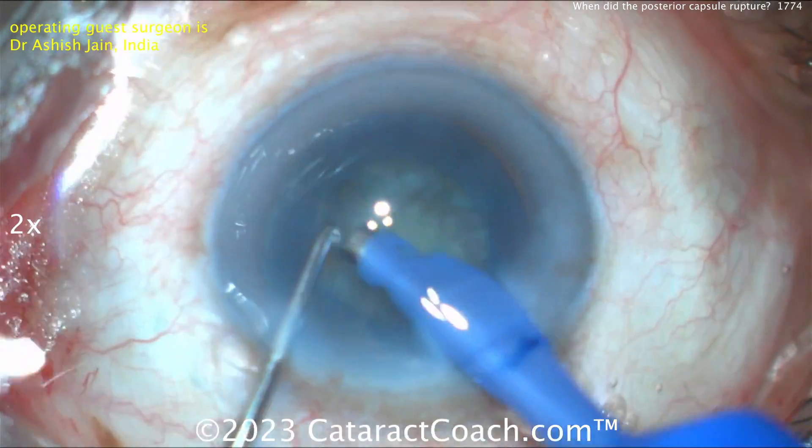Put more viscoelastic, but you may want to check for vitreous — maybe put some triamcinolone inside the anterior chamber to stain and see where the vitreous is. You definitely need to do an anterior vitrectomy in this case. You can see how it went from that one line down the middle of the posterior capsule to wide open — because vitreous pushed forward and pushed that capsule remnant out of the way. There's a big chunky tongue of vitreous now pushing through that open capsule up into the anterior segment. Anterior vitrector set up — good move — and feel free to use that triamcinolone, it makes life so much easier.